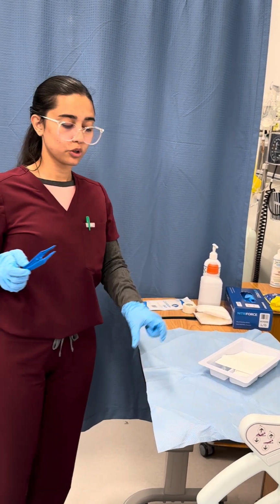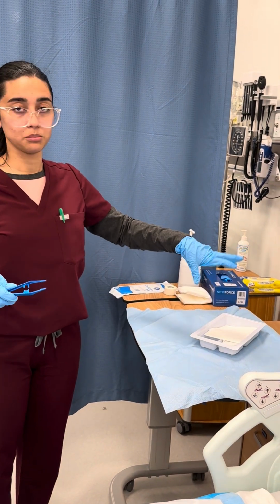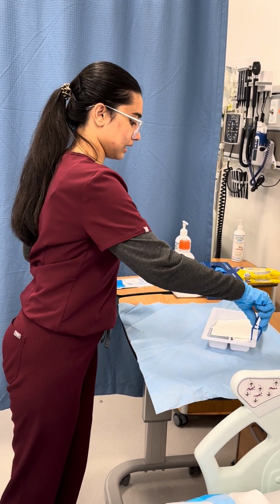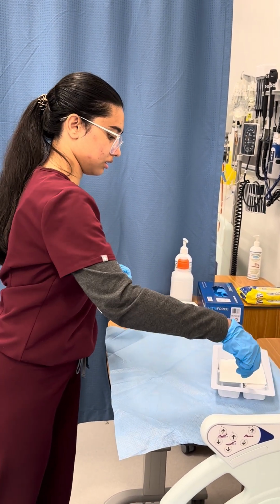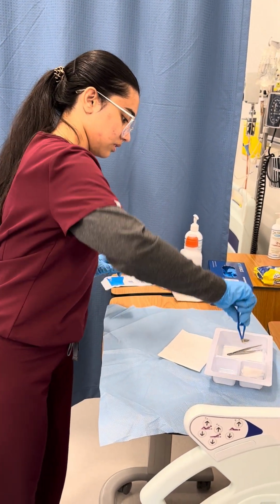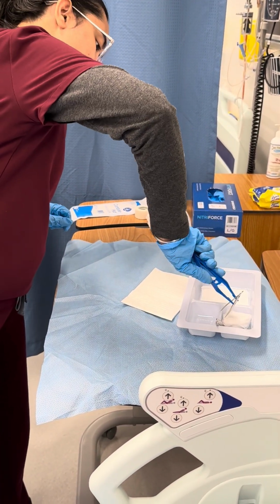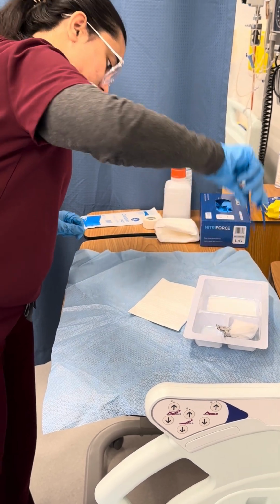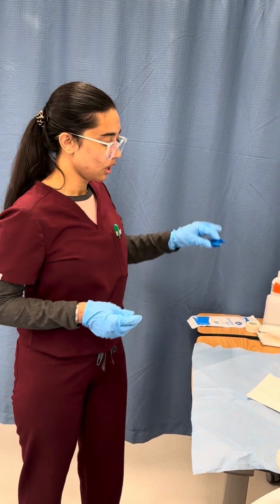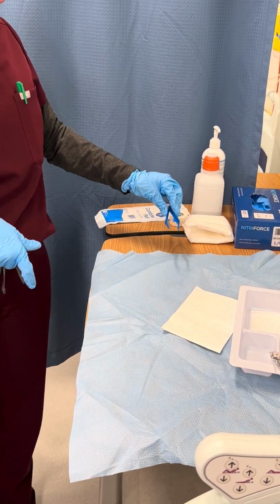So throughout the procedure, I'm going to maintain a 5 centimeter clean border, and inside the 5 centimeter clean border, the area will be sterile. So with the sterile tip, I'm going to manipulate the kit. So I manipulated the kit to maintain the sterility of the tip. I'm going to put the tip inside the sterile area, avoiding the 5 centimeter border.